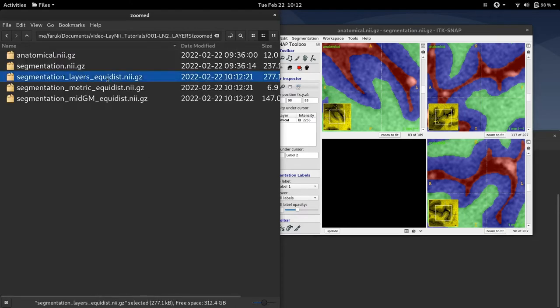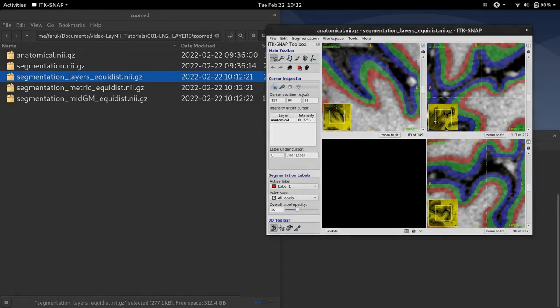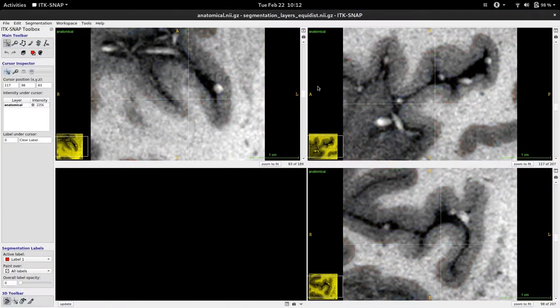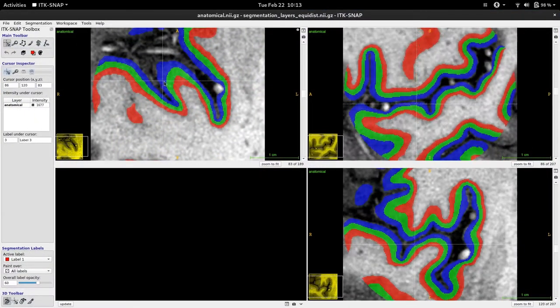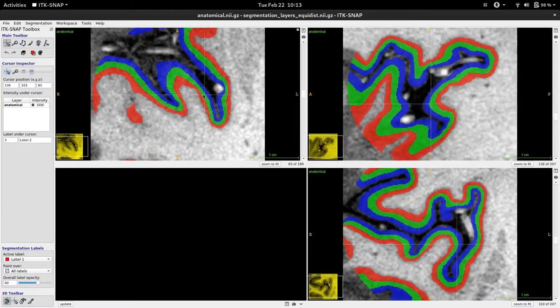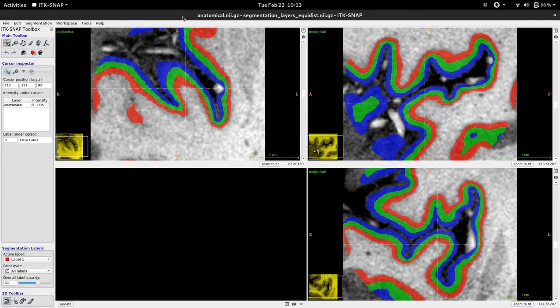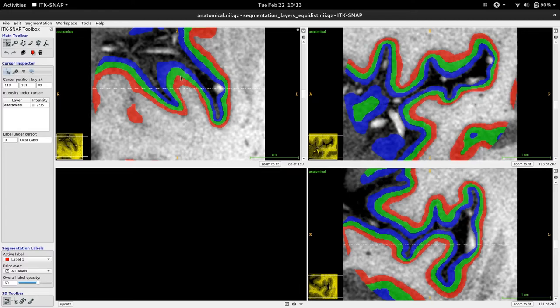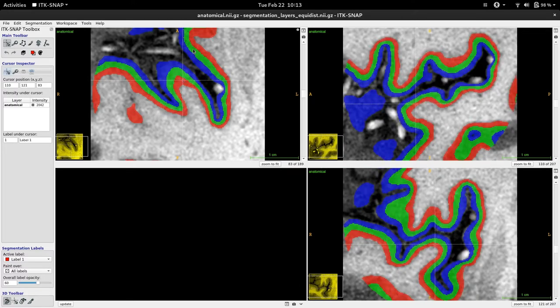First I'm going to load the layers file as a segmentation. This is often what many people want. However, there is another Laney output that is the basis of this file, which I'm going to show you next.